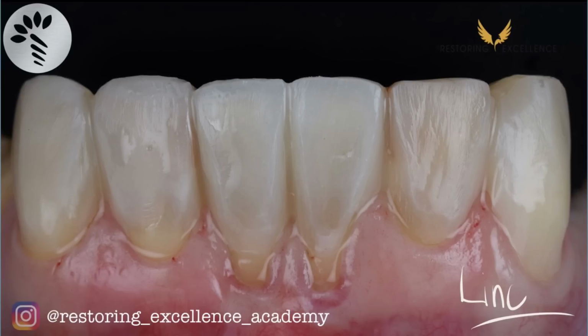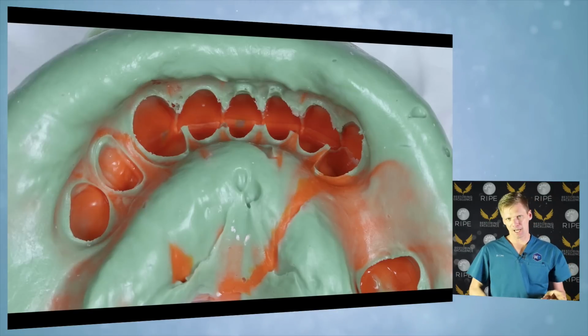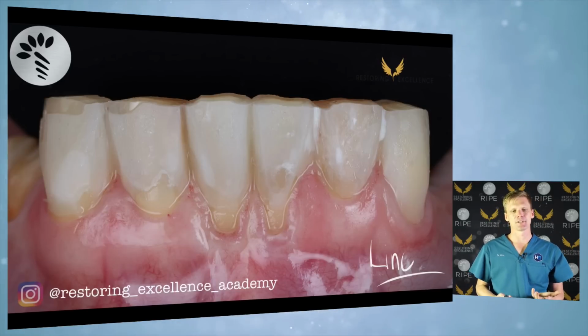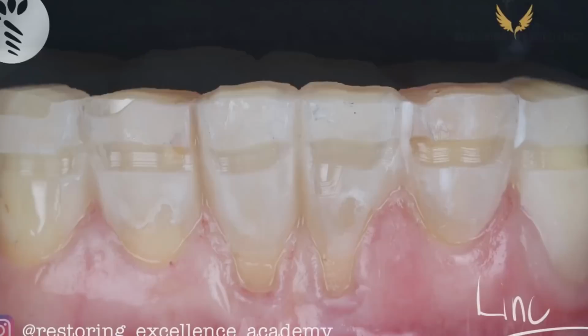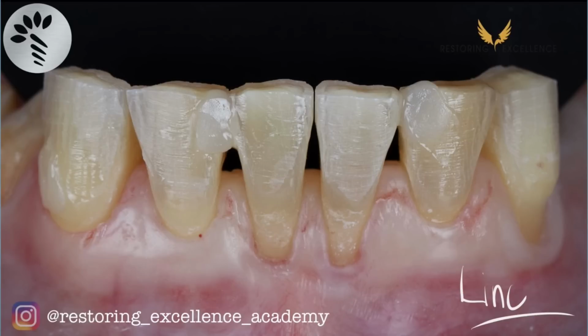That part doesn't really matter too much as far as the actual impressions go, but now we get to the parts of the procedure that do. So core build-ups. I need to have nice smooth preps so that I can get the silicone to flow. So we're going to need to do core build-ups. You can see I've done core build-ups there just with the same resin that I use for every other type of filling. And then we're going to prep.